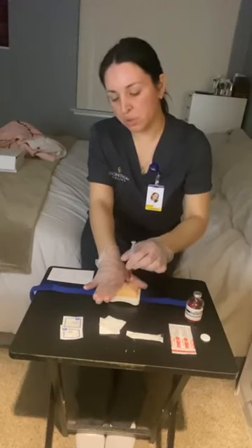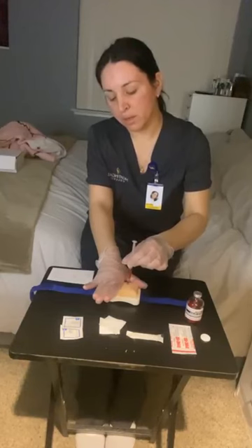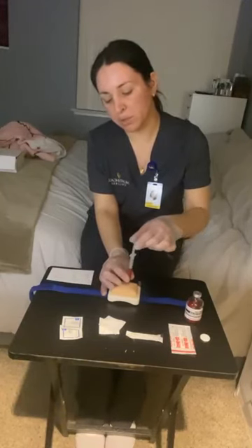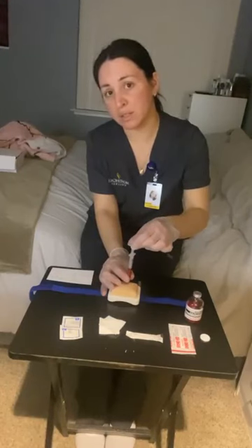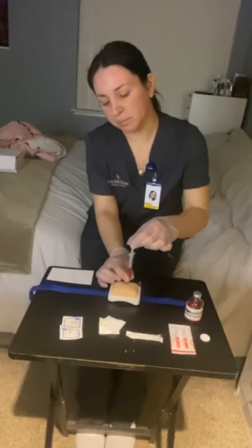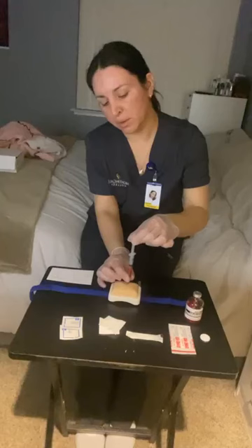and I do want to hold the barrel with my non-dominant hand at the bottom, and I do want to go back about 5 to 10 seconds, make sure I see no blood. So I'm pulling back on the plunger.